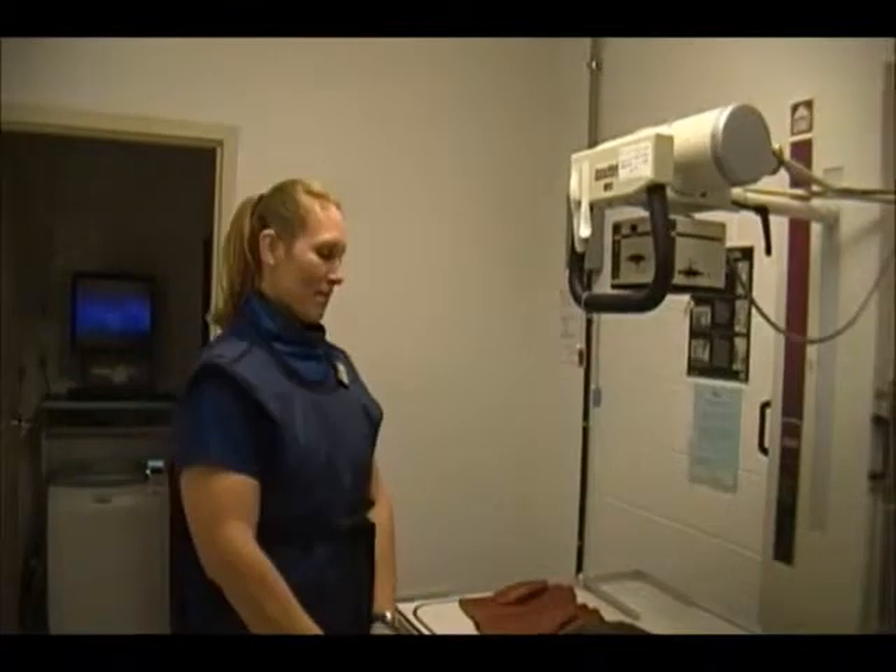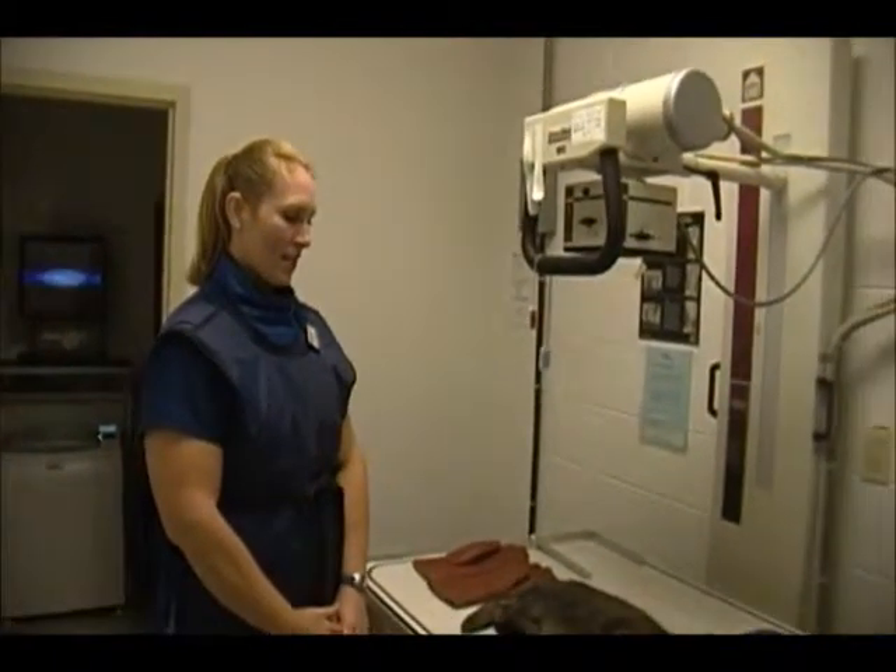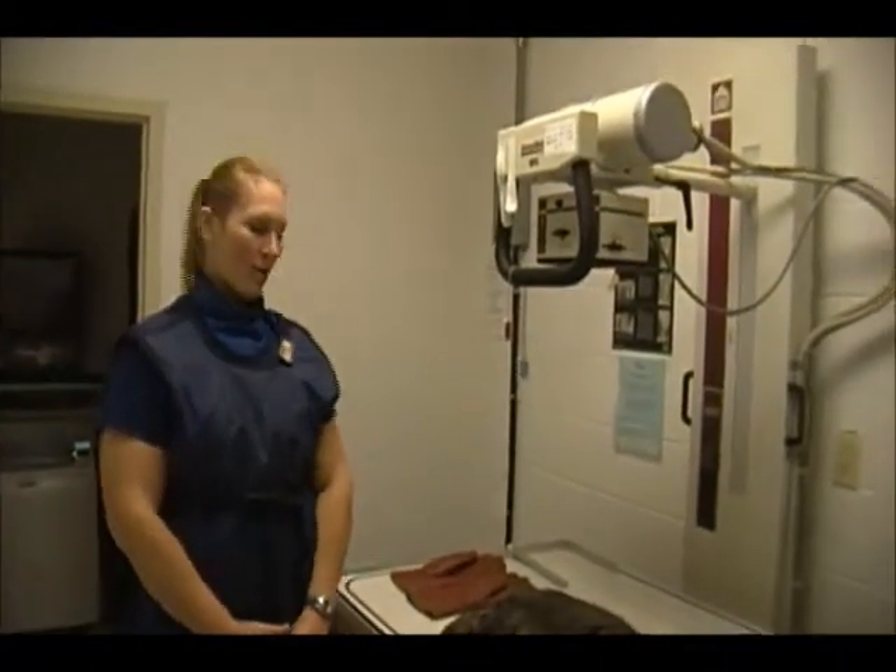This is Amanda Compton for my VET122 radiography video. This is going to be positioning a cat for the abdominal radiographs.